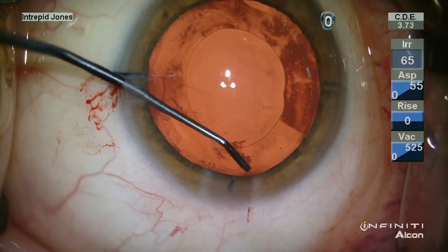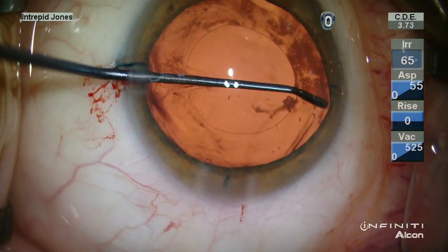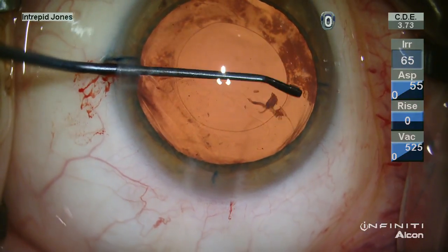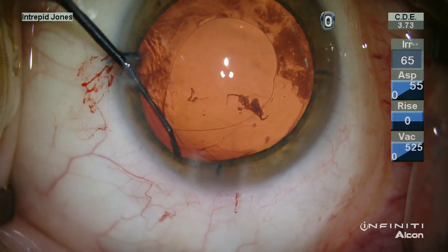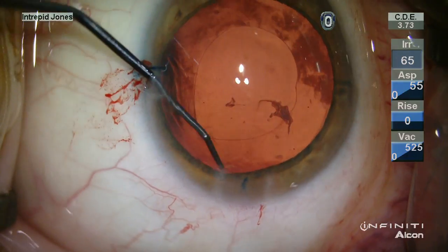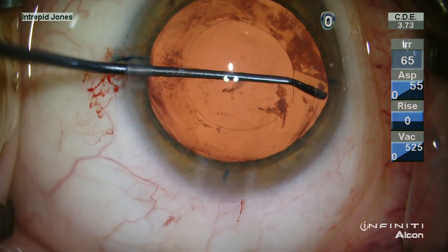This allows me to reach the subincisional undersurface of the anterior capsular rim via my standard paracentesis, and as you can see, it efficiently liberates significant material from the capsular rim.